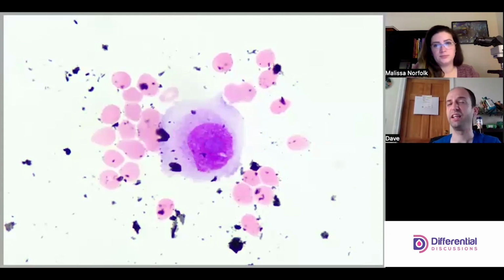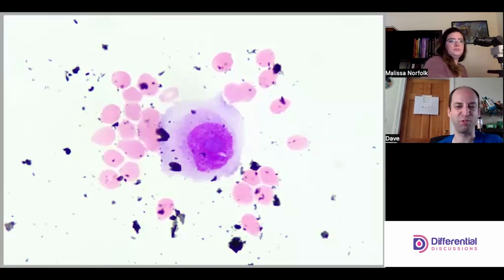My mind keeps going back to meso. Mesothelial cells tend to have this fried egg kind of look, and this is like a weird inverted fried egg. But yes, very abnormal, weird looking. Don't expect to find this in a CSF. So this is going into my other.